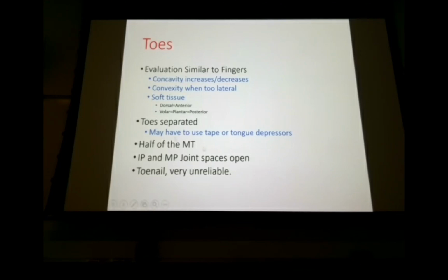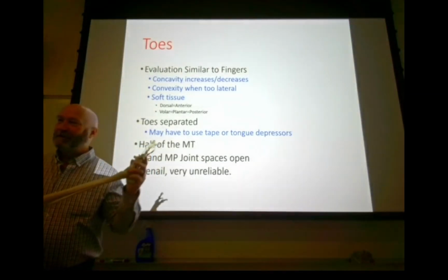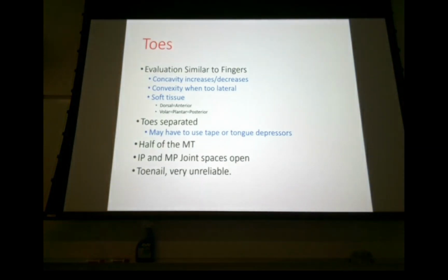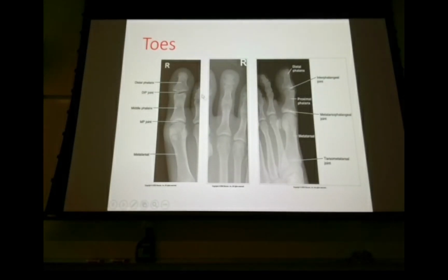So we're going to include about half of the metatarsal, and the toenail. The book says you can evaluate rotation using the toenail. Have you seen feet? And I say these toes look pretty bad, but that looks like most of my patients that had toe issues. So, toenail's not very accurate, especially on the lateral side. That fifth toenail may be really on sideways, so you really can't use the toenail that well. So, if you don't angle the central ray, you're going to get closed joint spaces.